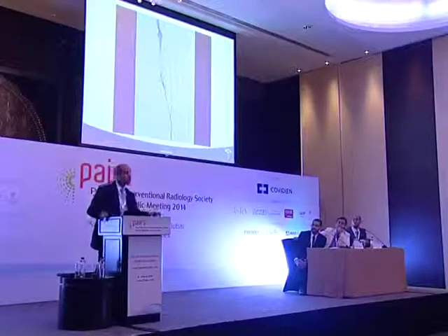Do you think this stent landed in the subintimal tract, the stent that was placed? Unfortunately, I didn't have the original angiogram after the initial stent placement, but the report is that it was a subintimal passage, but they obtained a good result at the end with inflow to the TP. So one thing that worries is the angioplasty, and there's an area that was not as good, so the stent was partially in a subintimal tract. So yeah, maybe that's why there's a fistula.